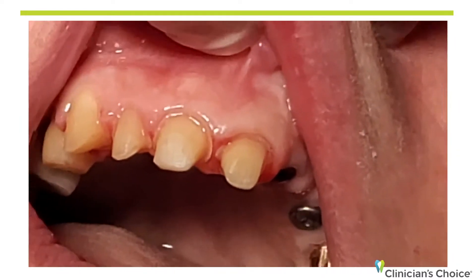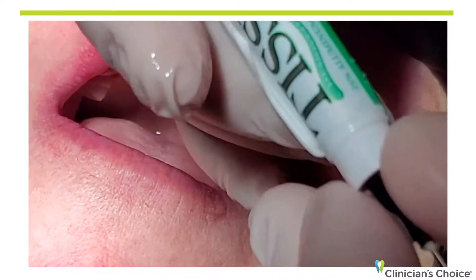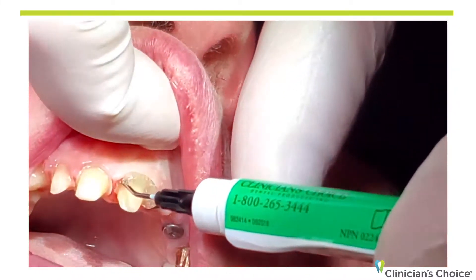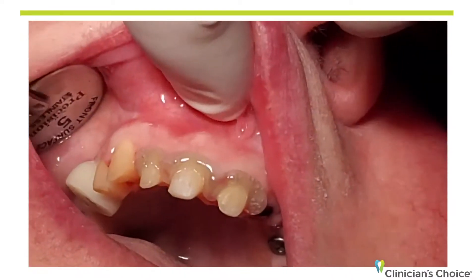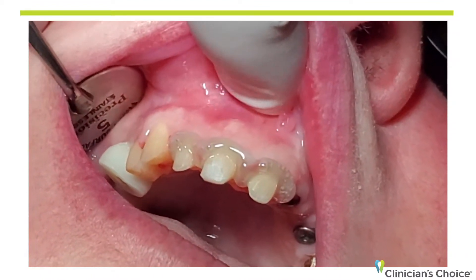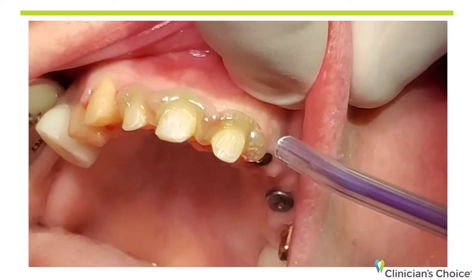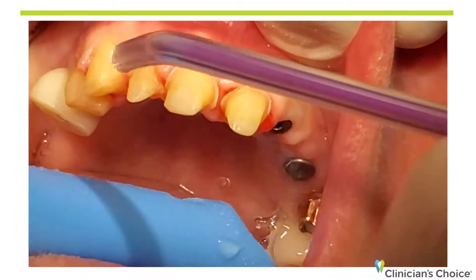I have some areas here that are a little bit red, almost like bleeding a little bit. So I'm going to take a little bit of Tissue Goo, which is a Clinician's Choice product — it's a 25% aluminum sulfate gel — and I just want to absorb any of the bleeding. Because the diode, as we know, is absorbed by pigment and hemoglobin, and I just don't want to fight through any of the bleeding. So I'm going to leave it on just for a few seconds, let the aluminum sulfate do its thing. Suction please — open really big — and we're going to rinse it off, just making sure there's no bleeding going on.